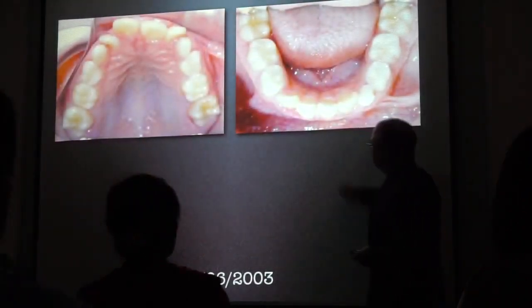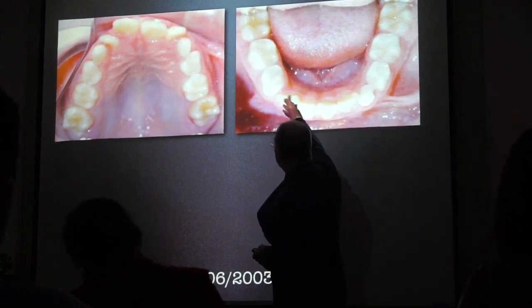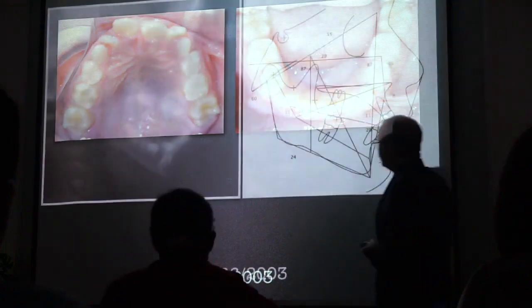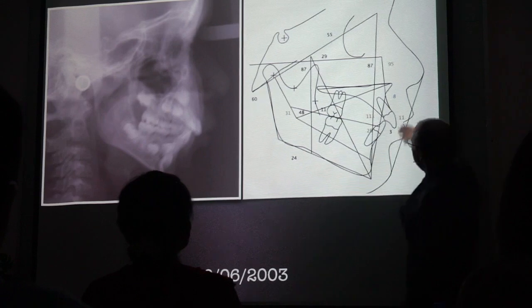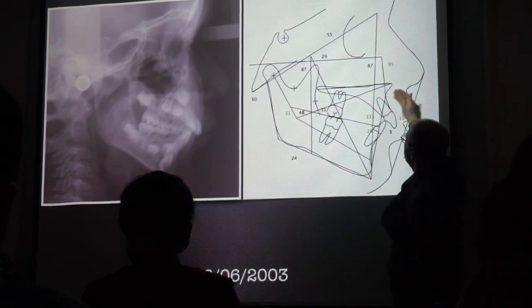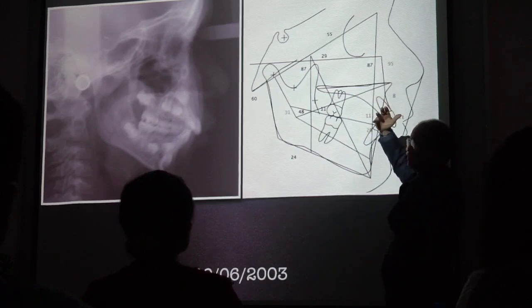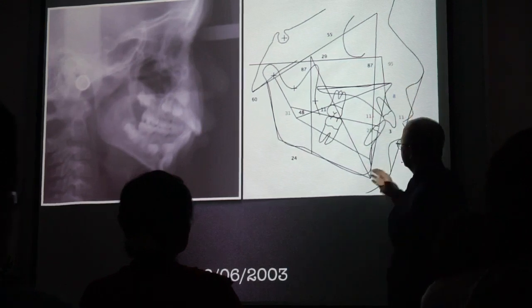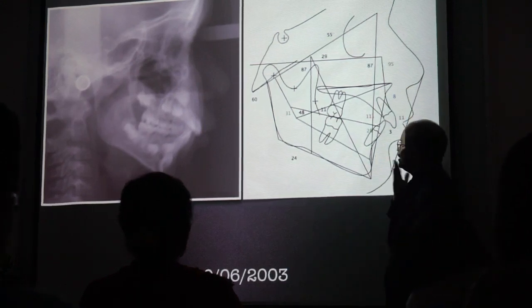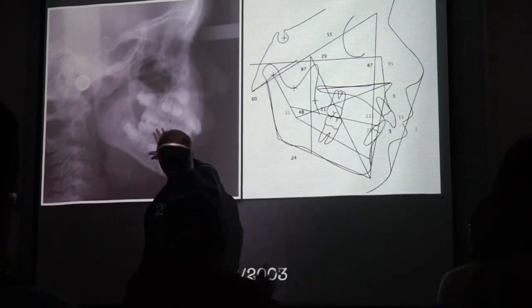So we have skeletal discrepancy, dental discrepancy. If you see the cephalometrics, you see convexity. So I like kids with 5, 4, 6 maximum convexity, but 7, 8, 9, 10 is too much. So these kids look like they have deficiency in the mandible. So we should help.